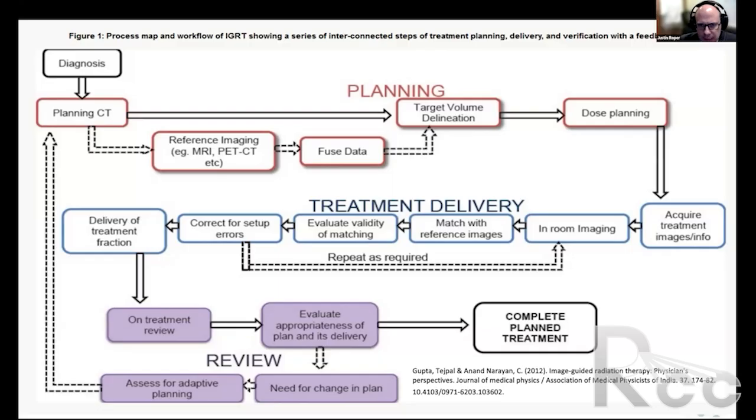And the notion is that these images then guide how to fine-tune the patient positioning and get them into a better spot for treatment. Further, this IGRT information, in particular when it's a 3D cone beam CT, can be used to evaluate any changes in the patient's body habitus or changes in tumor volumes that could then prompt a repeat simulation when needed. And so at a bird's eye view, this is the IGRT workflow.